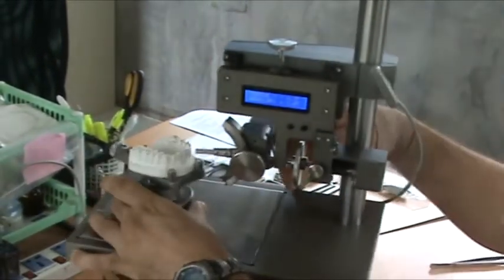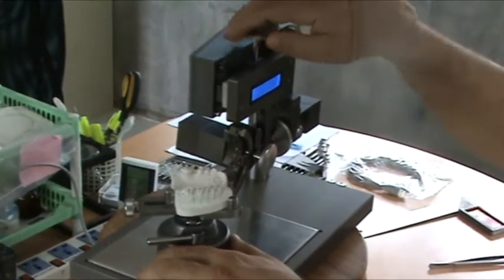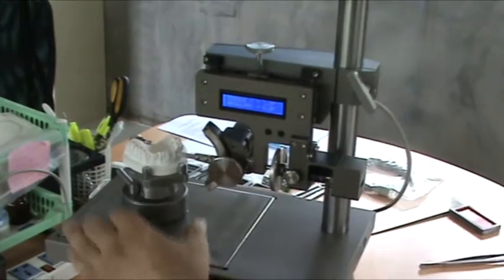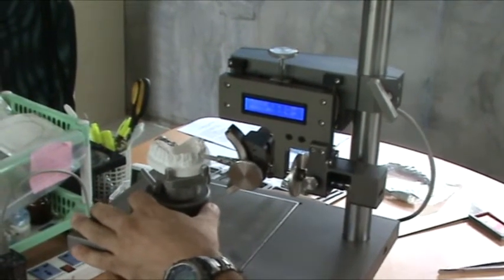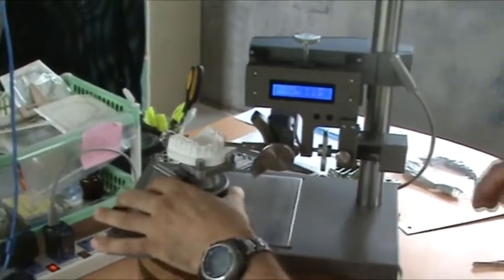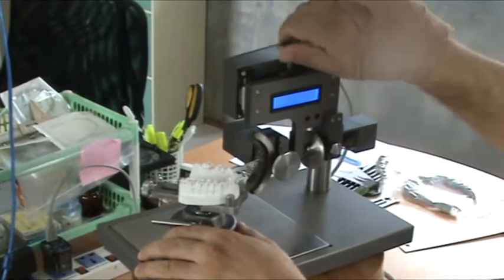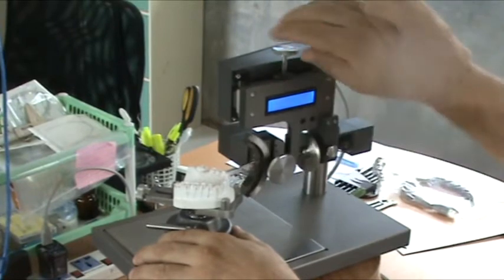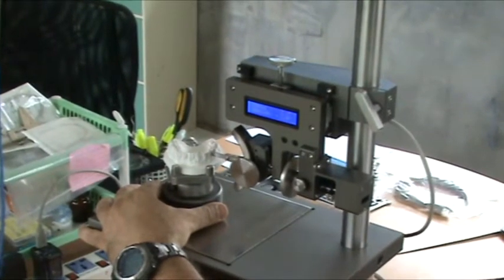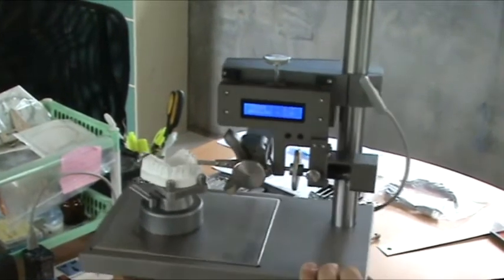Once we've set the plane, you can measure a tooth, you can move to the next tooth on that side of the arch, set your tip, set your height, set your torque. And then you get an idea of what that tooth is in real values for tip and torque. Torque 1.5, tip is plus 6. Same, we move round. Very quick, very easy to use. That's it. We have another measurement, minus 2.1 for the canine, torque and tip of plus 2.5.